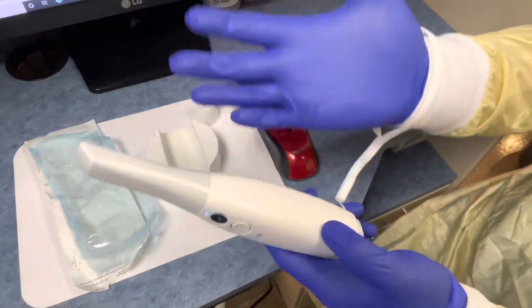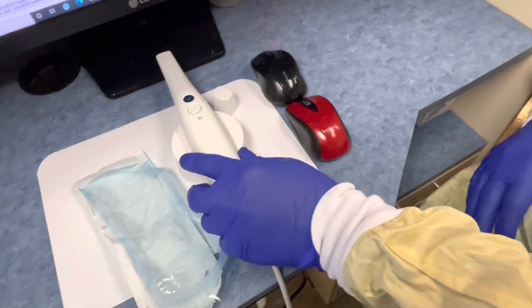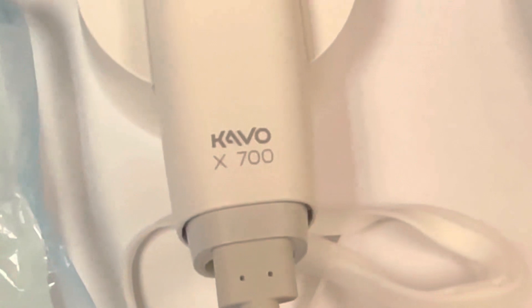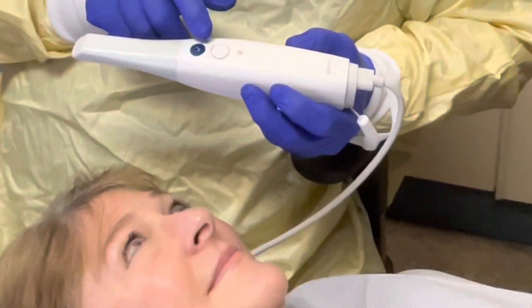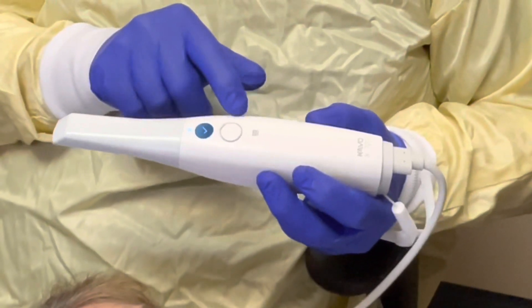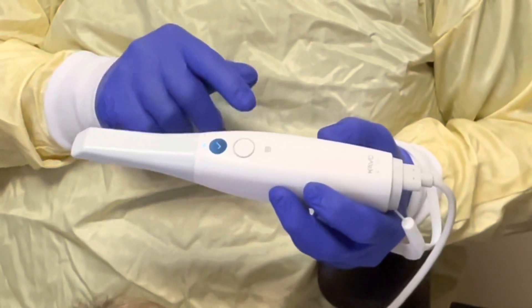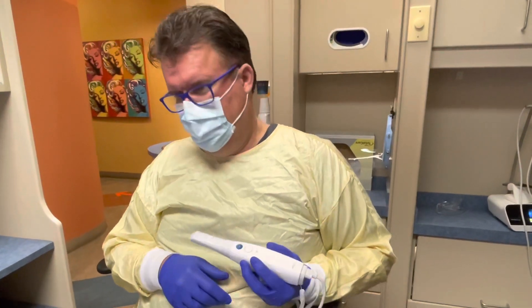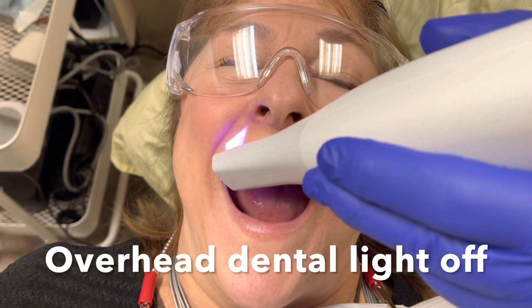The wrist strap is new too — you can grab that in case you accidentally drop it, which is also good to have along with the cord. We have cordless scanners in our office as well, but the cord will help if it drops. The x700 — which is the i700 — is a really good camera. Now, this mouse button next to the check button is brand new to the system and it's going to make your life easier because it allows you to keep your gloves on longer. It's all about how long you can keep your gloves on when you're scanning.